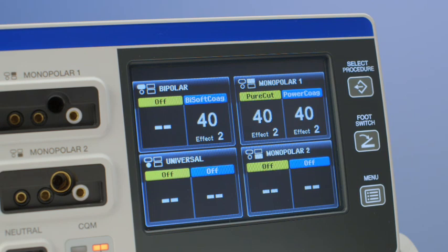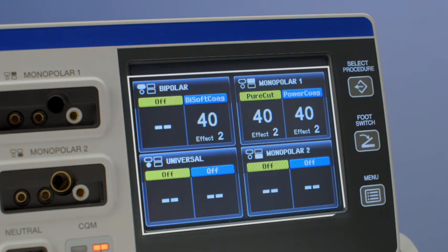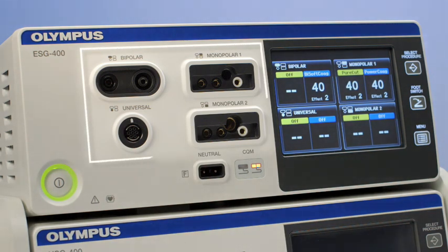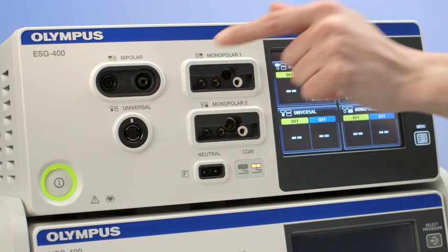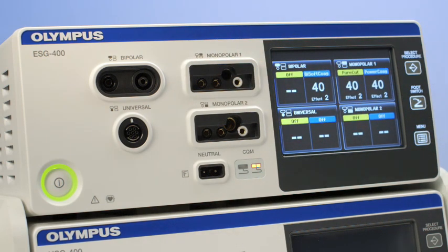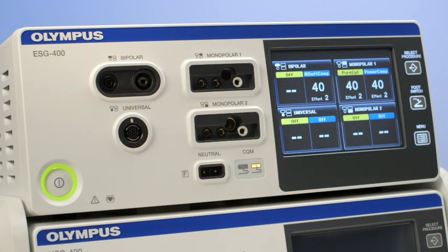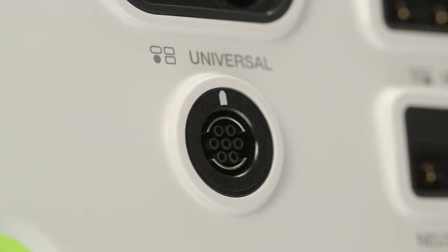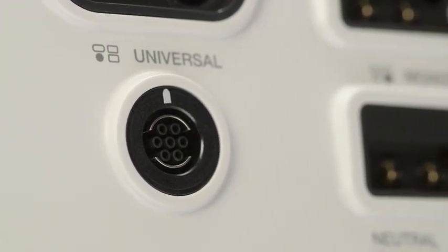When you switch on the generator, a graphical user interface lights up. The graphical user interface is divided up into four quadrants. These four quadrants correspond to the four instrument connection sockets in the connection area. You can connect two monopolar instruments, one bipolar instrument, and Olympus proprietary instruments using the Olympus universal socket. The universal socket is used for Olympus electrosurgical products and features instrument recognition.